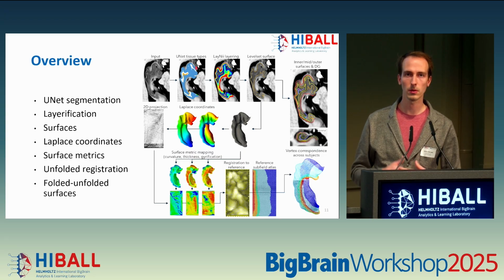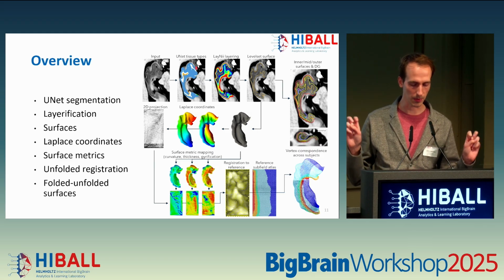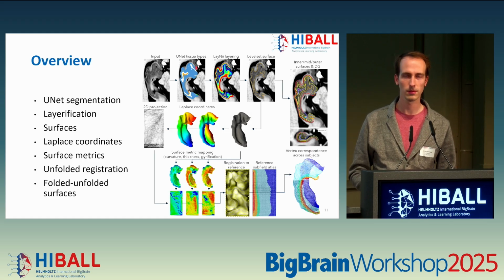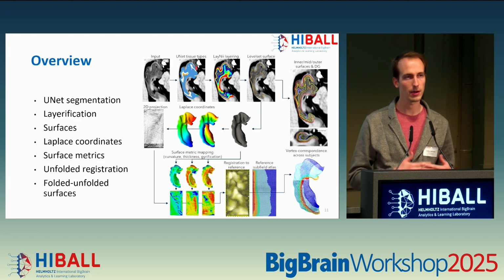You give it your input MRI image, and it will crop around the hippocampus for you, which you can see in this footprint shape, sometimes called pes hippocampi. We'll then use nnU-Net, the classic tool for classifying these different tissue types, including the SRLM laminae that look darker in MRI, depending on the contrast. And then we'll do this layerification.